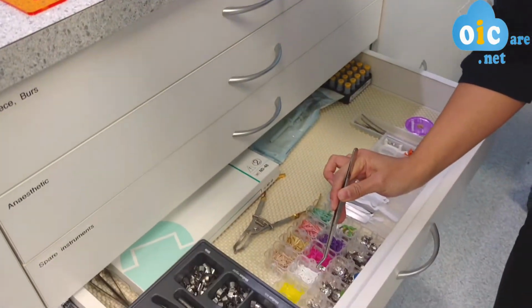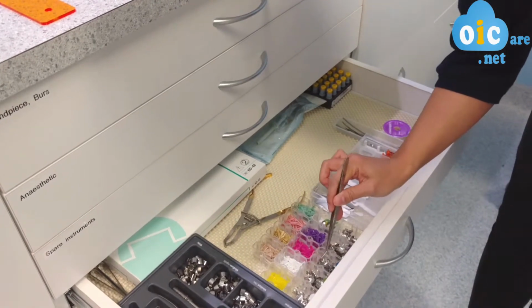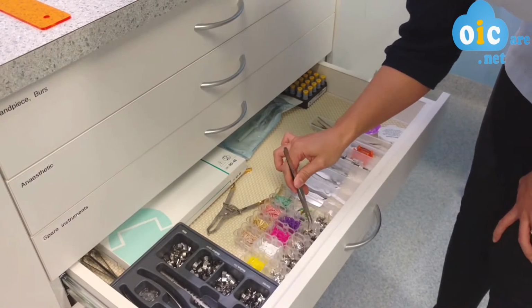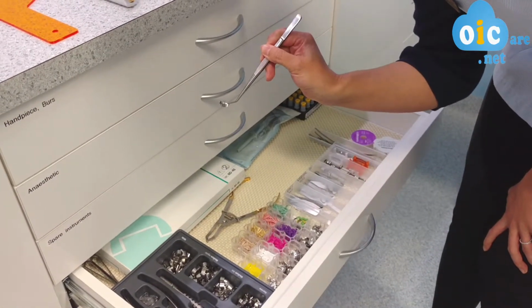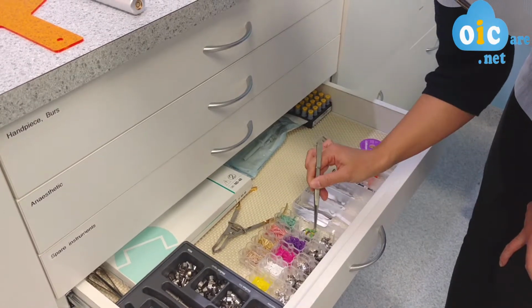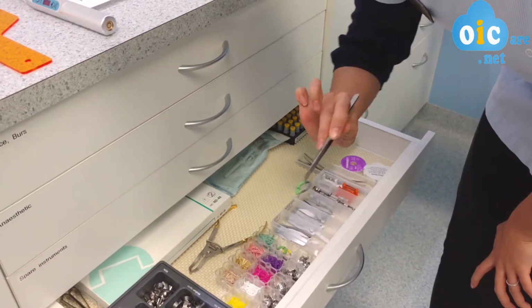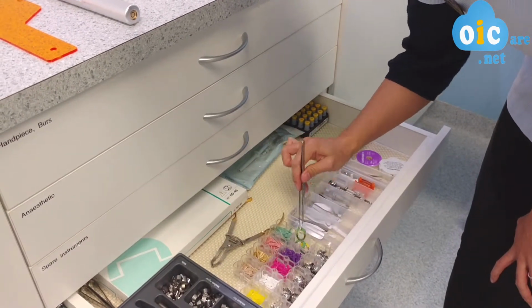They come in different sizes. That's a small, and then we have a medium, and large and extra large. They all come in different shapes. If the cavity is very deep, then we will use something like this, and then we put a clamp like this on your tooth to keep the band in place. These are called sectional matrices, and this is just a holder to hold this clamp.